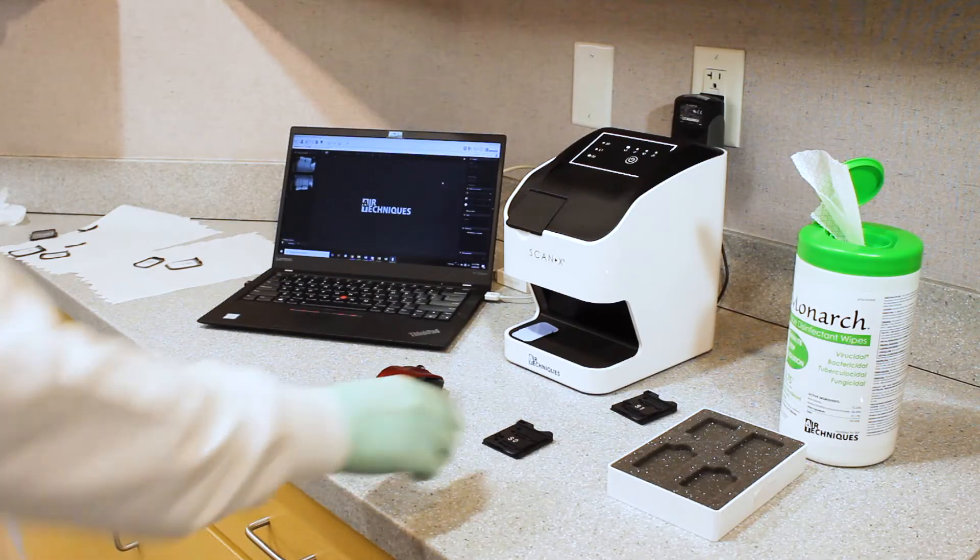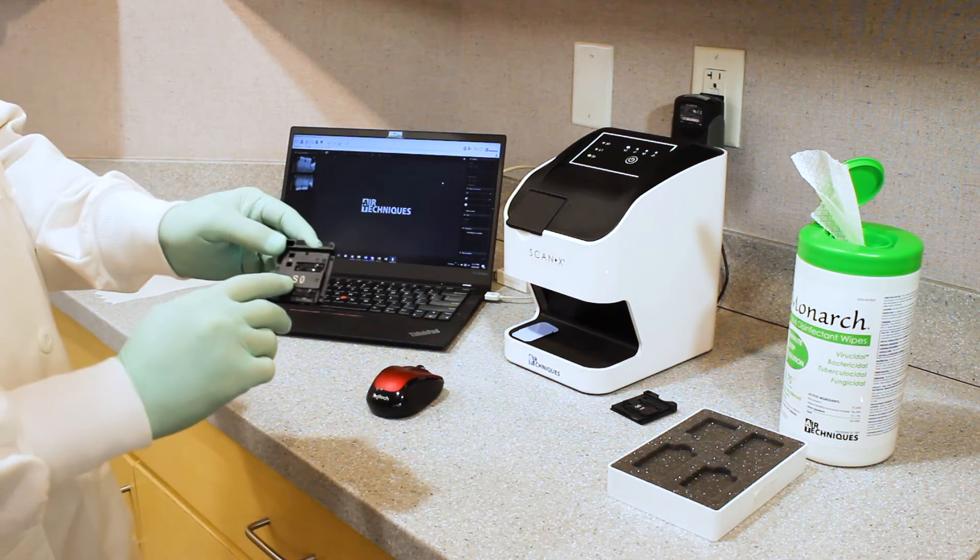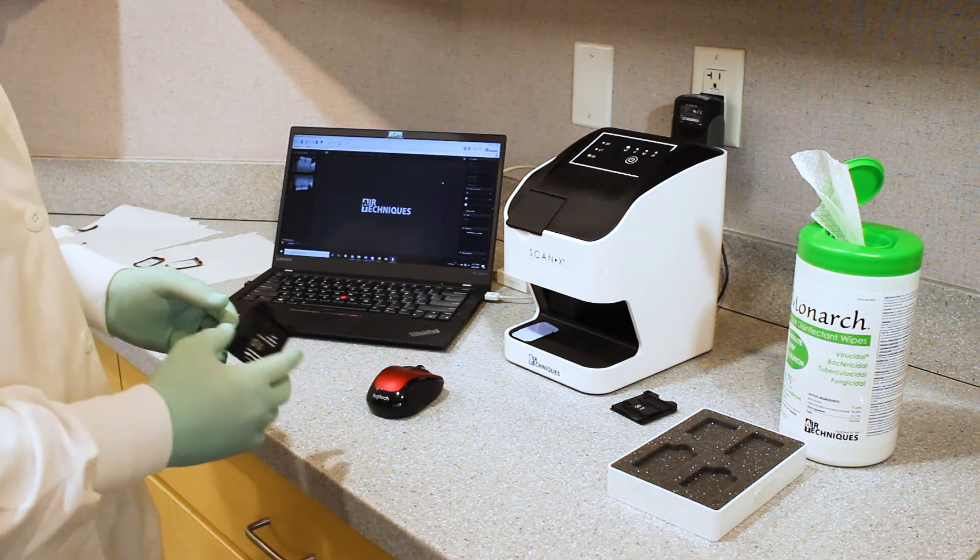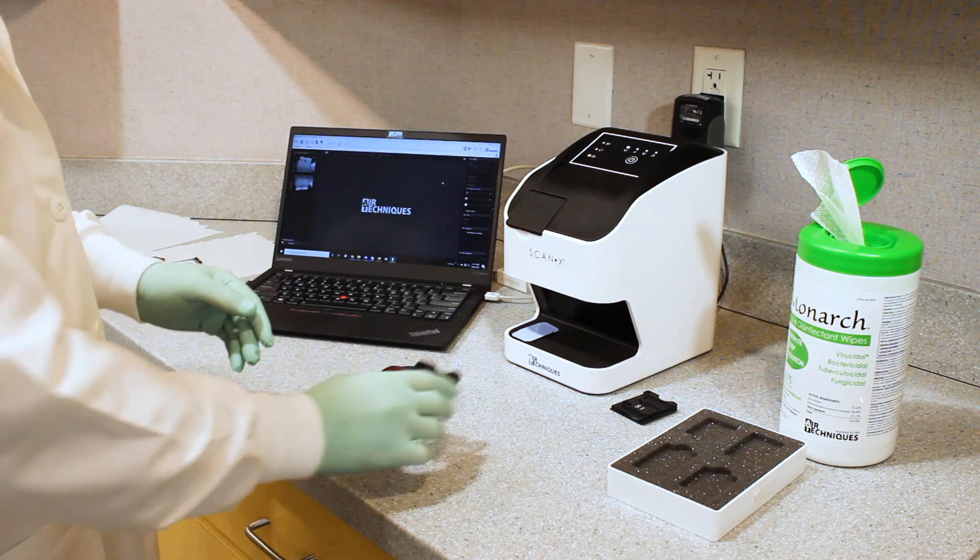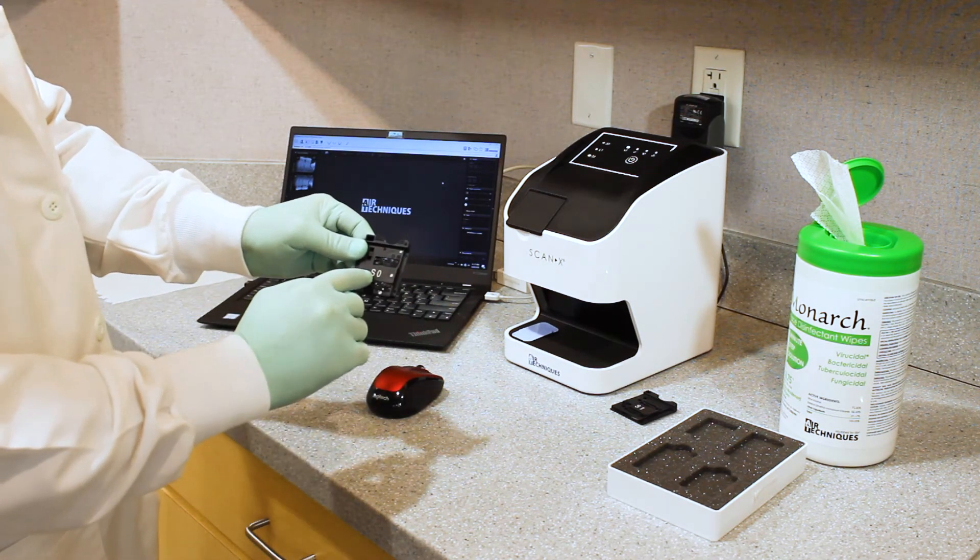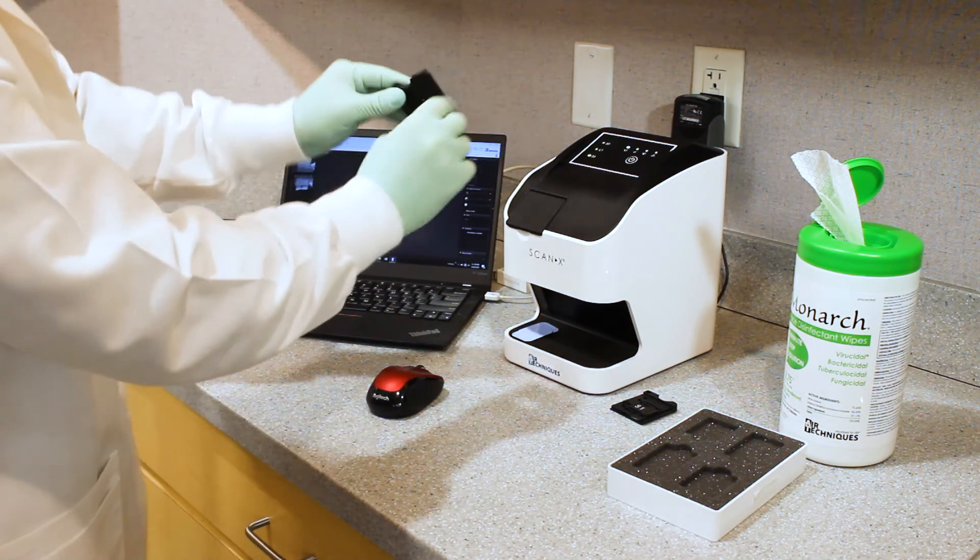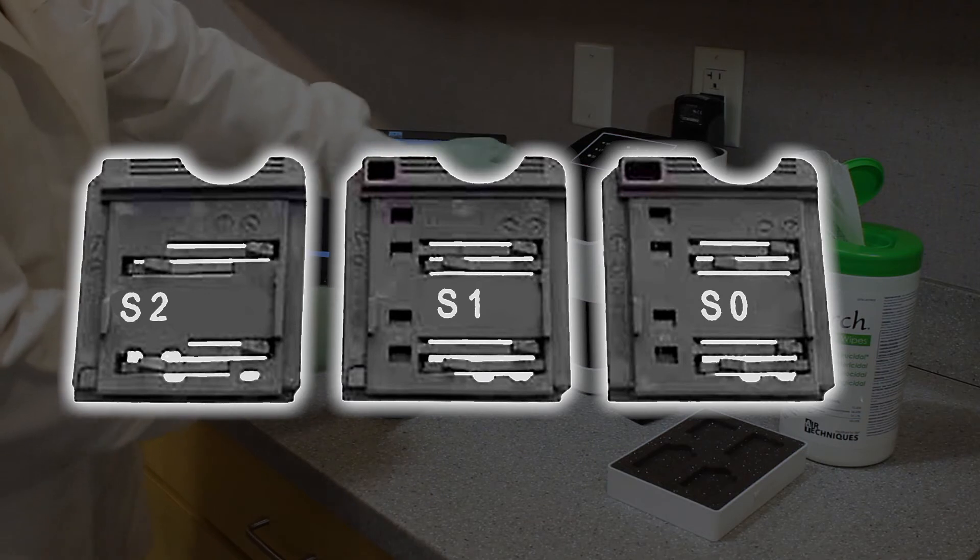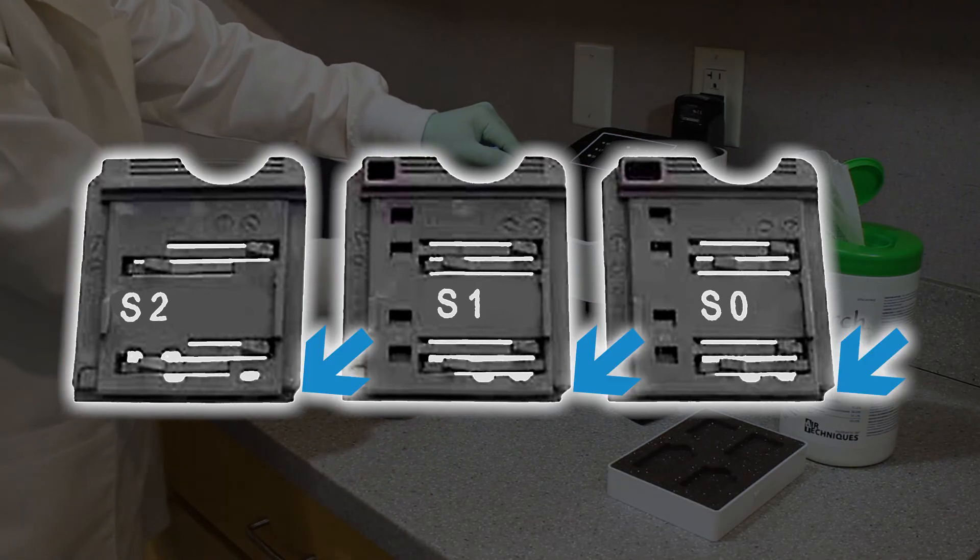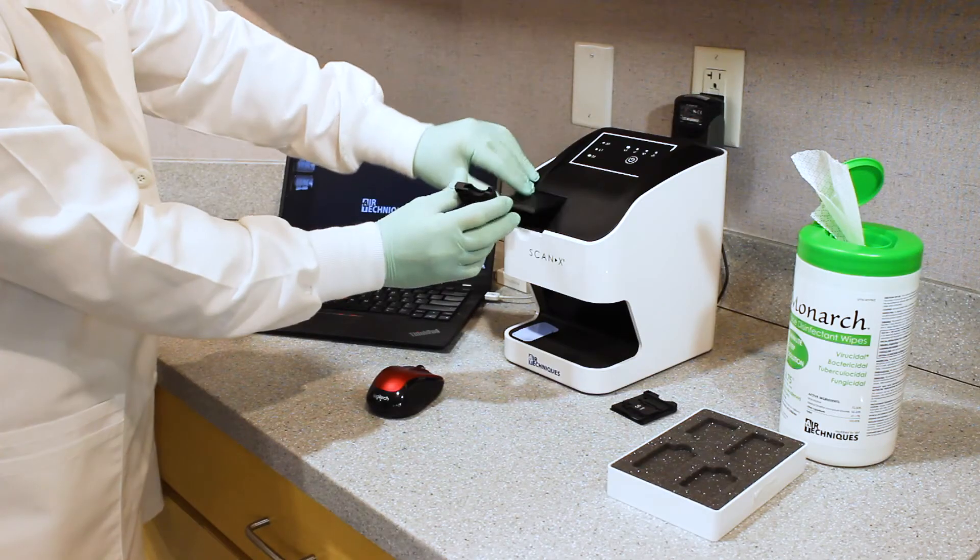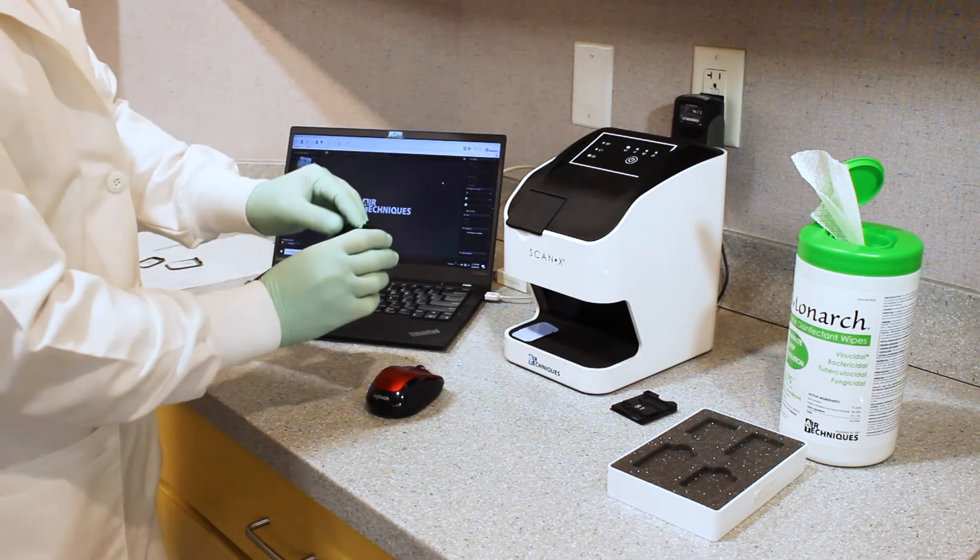For the next part, we're going to talk about inserting a size zero cartridge to allow us to scan a size zero phosphorus storage plate. So essentially, the size number is always going to face you as the user. So it goes in this way, it does not go in this way. And it is keyed so you can see which is the correct orientation, meaning we have steps on this side where it's a straight wall on that side indicating it's only going to go in one orientation.